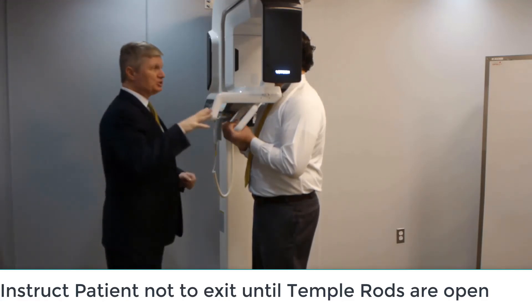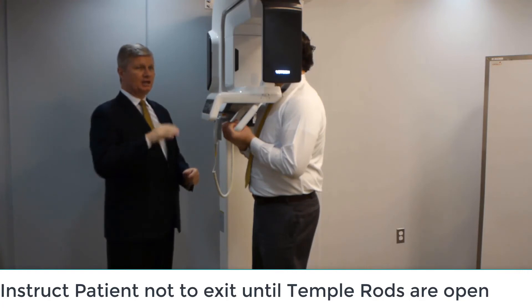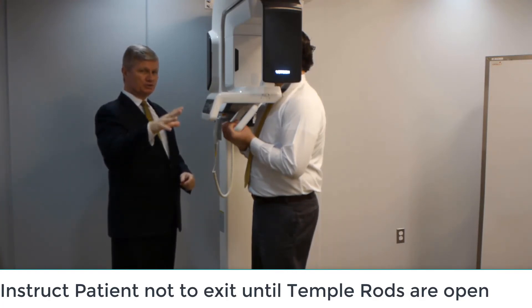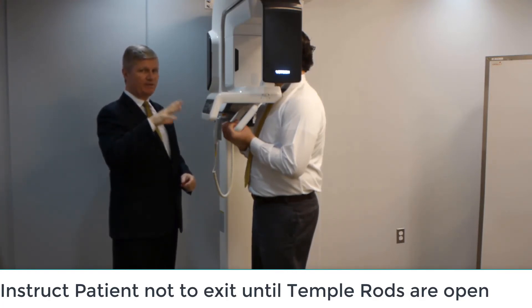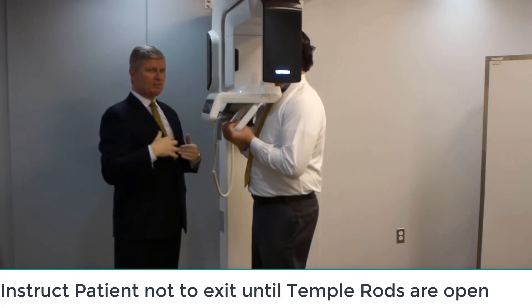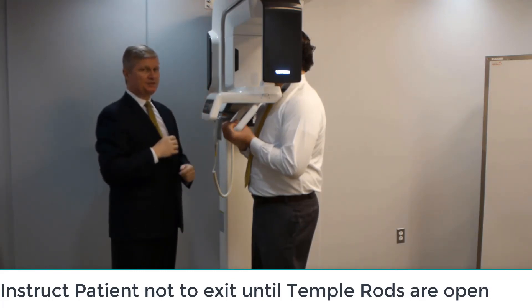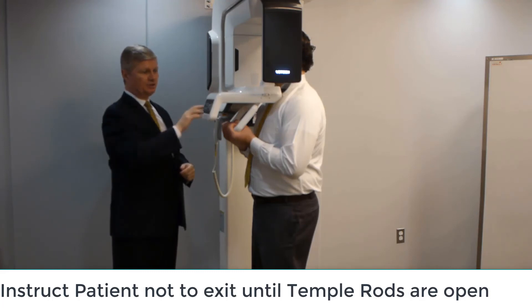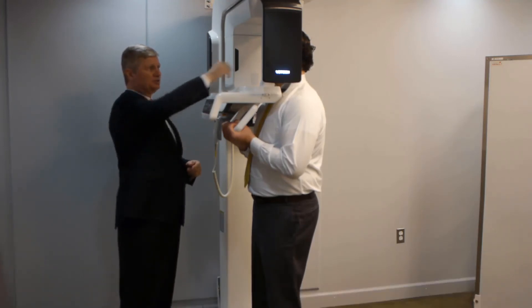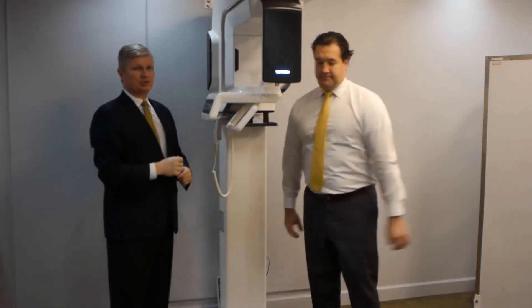We've captured our image successfully. Now we're ready to release our patient out of the device. As a cautionary note, instruct the patient not to try and exit the device until you come back in the room, open the temple rods, and then they can exit the device. Clicking the button to open the temple rods and pulling back so the patient can exit — we're done capturing our image.